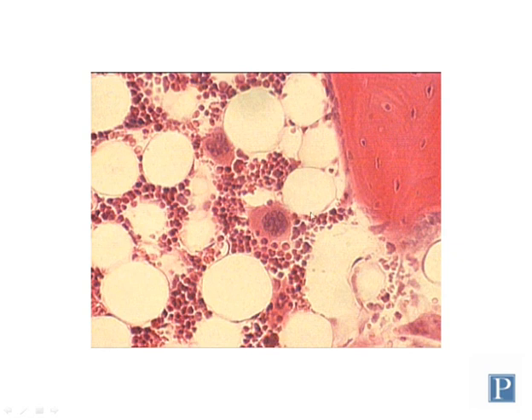One of the cells you can see here that we haven't talked about yet are called megakaryocytes, and these are huge cells with very large nuclei. And that's really where they get their name, megakaryocytes, cells with huge nuclei. And the cells themselves are just quite big. They're almost as large as adipocytes, and they're many times larger than red blood cells.